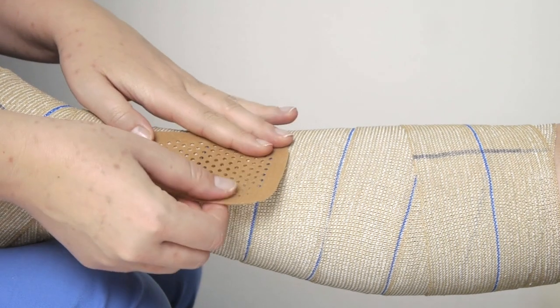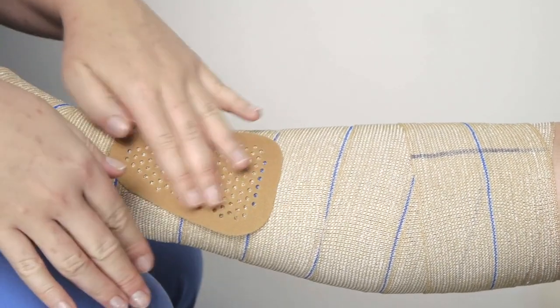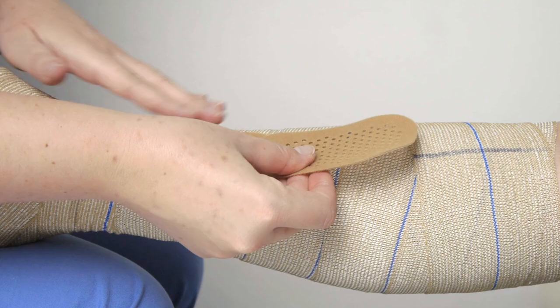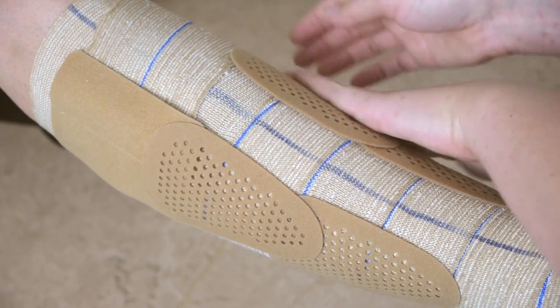Press patches are used to create a custom hard shell, fitting even the most irregular leg shapes. Make sure that the patches overlap one another by about 1cm.